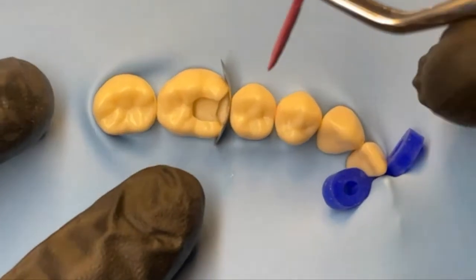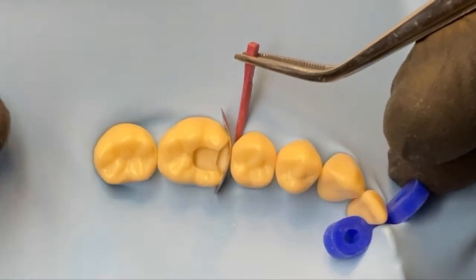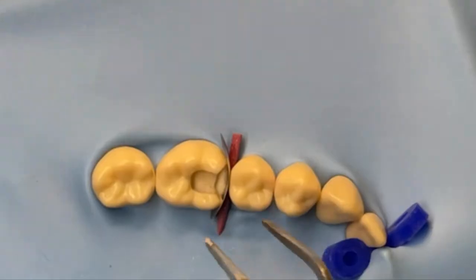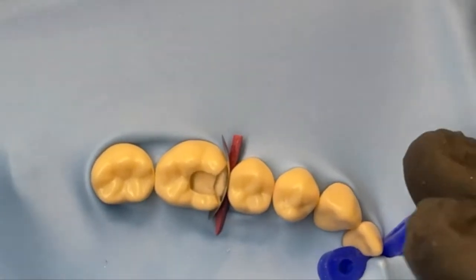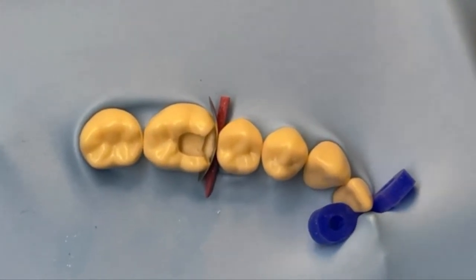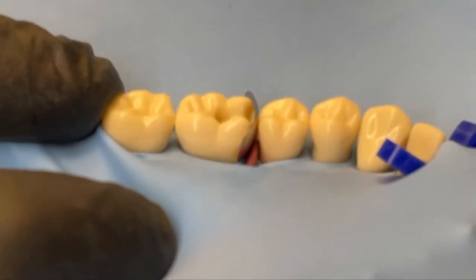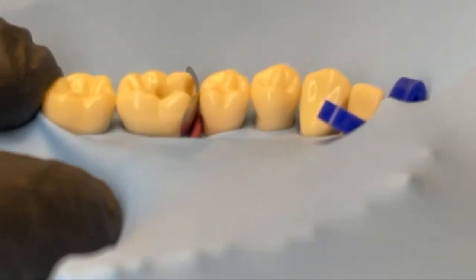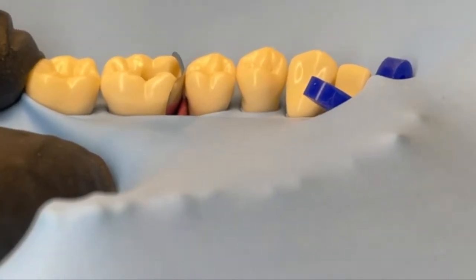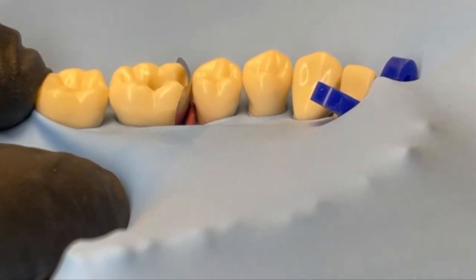Once it's in place you're going to wedge it. Having tried everything, I like to use a wooden wedge almost all of the time - you can place that and get a really nice firm wedge. They're more environmentally friendly, cheaper, and they work really well. Don't feel you have to use what's in the kits - mix and match, it's all about the principles. Can you see the difference from the circumferential band we used earlier? We've got that real nice curve going back on itself, the contact point in the middle of the contact area.